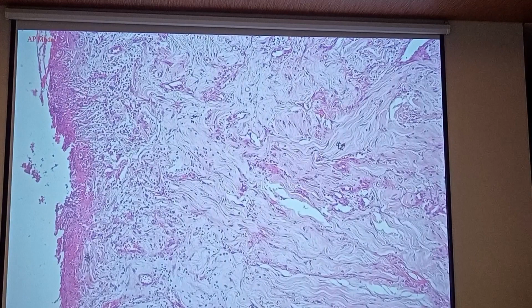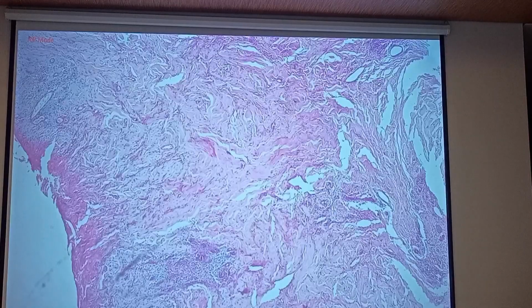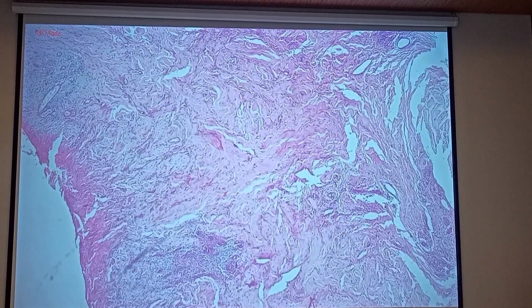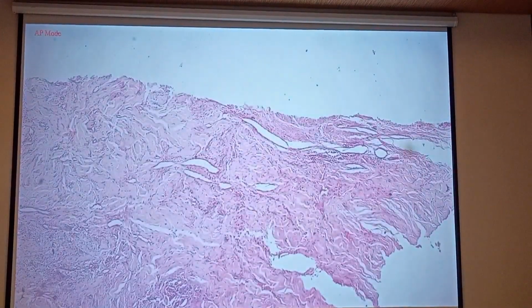Mononuclear infiltrate. These are lymphoid, and sometimes you can appreciate macrophages in there. It's mostly scar tissue and no longer chronic inflammatory response. So when you see this, just say scar tissue. I cannot see even what part of the body this is.